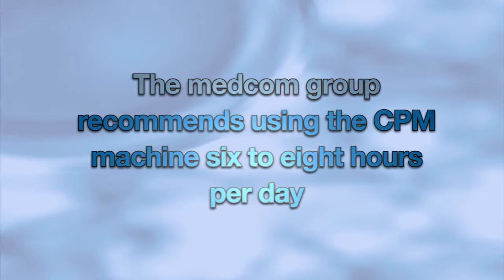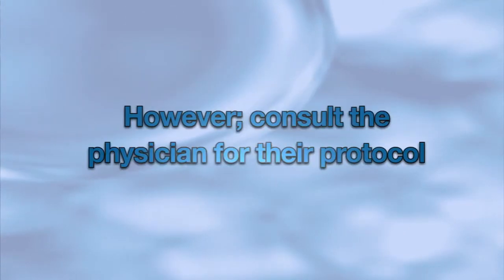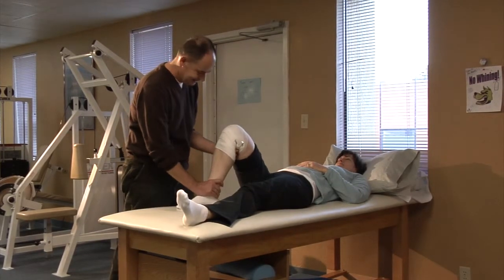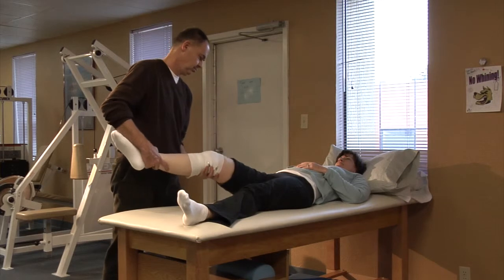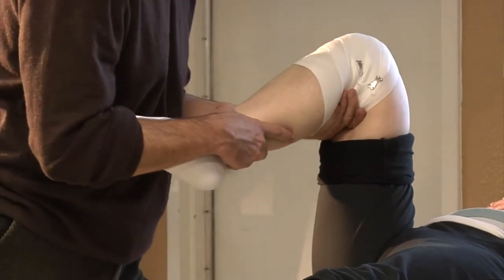Studies have shown that 40 to 50 degrees of flexion will maximize the edema-reducing benefits of CPM therapy. The Medcom group recommends using the CPM machine 6 to 8 hours per day. However, consult the physician for his or her specific protocols. The physician has probably ordered physical therapy for the patient as well. If this is the case, it's important that they complete their daily exercises along with using the CPM machine. CPM usage is not a substitute for their exercises. However, the combined benefits of both therapies will help them recover more quickly.